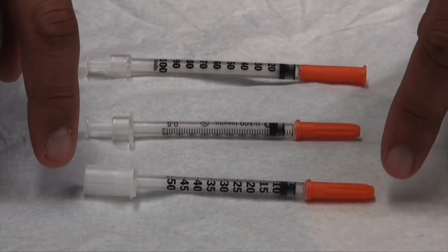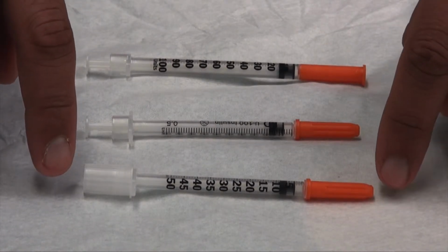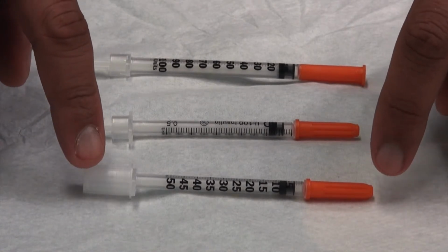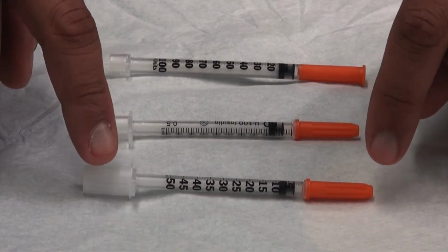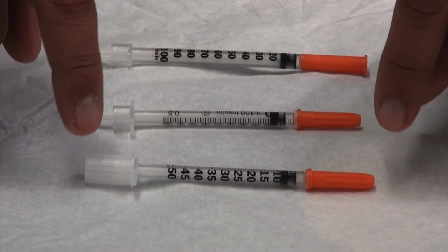However, there is a variation of the 0.5 ml insulin syringe that comes with a shorter 8 millimeter needle and also a finer 30 gauge caliber.